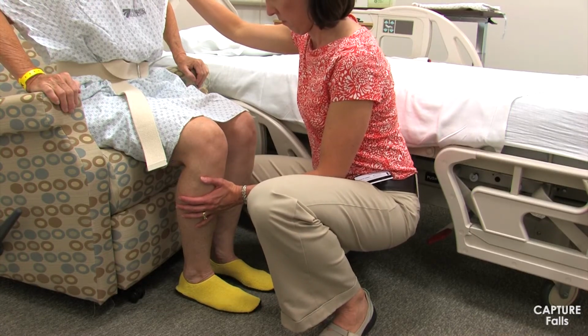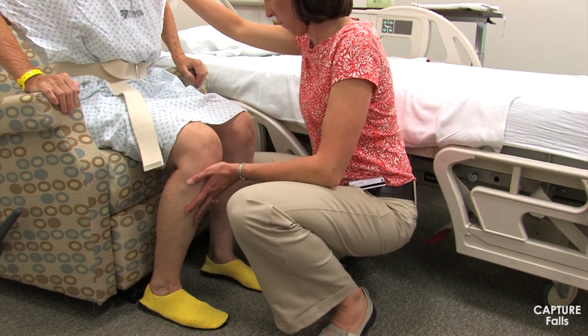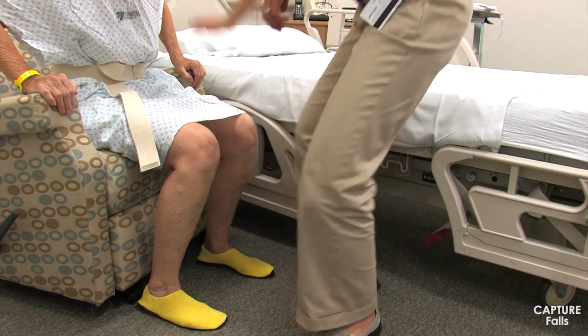If the patient has one leg that is stronger than the other, it might be helpful to have the individual pull the stronger leg back relative to the other one so that it is closer to the chair prior to standing. This position allows the stronger leg to raise the body most effectively to a standing position. Both feet should still be shoulder width apart. If the individual does not have one leg that is stronger than the other, positioning one foot posterior to the other is less important, but you should still ensure that both feet are shoulder width apart to maximize the patient's ability to balance once they are in standing.